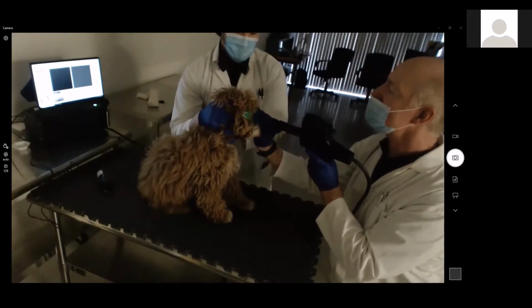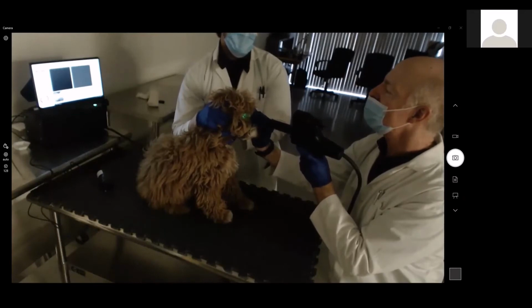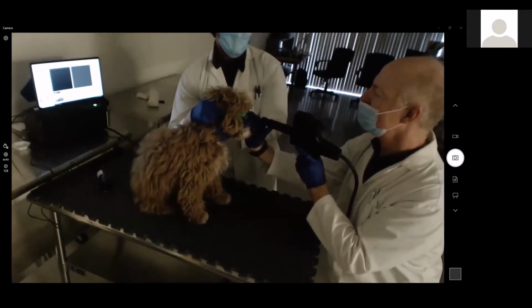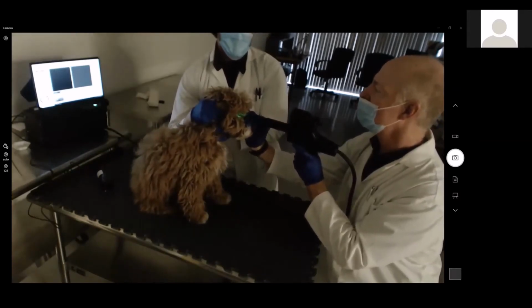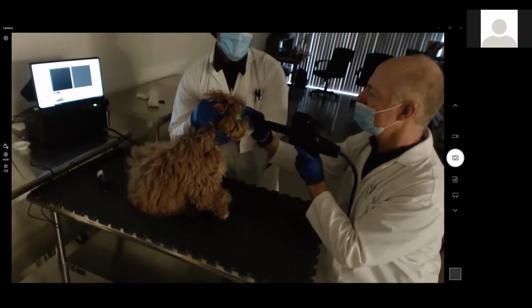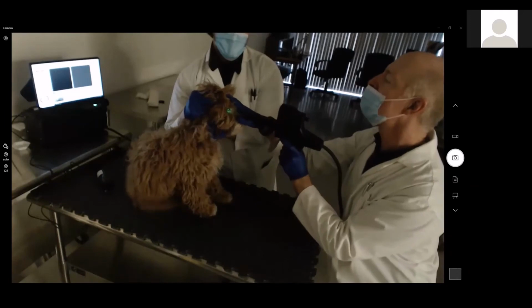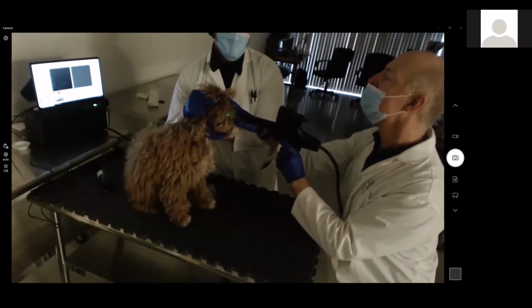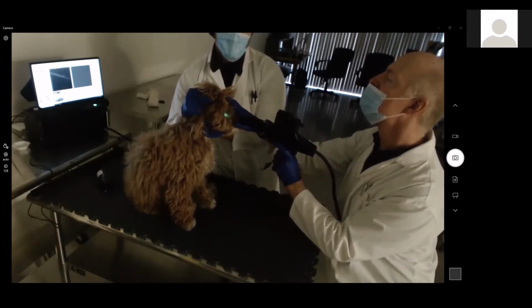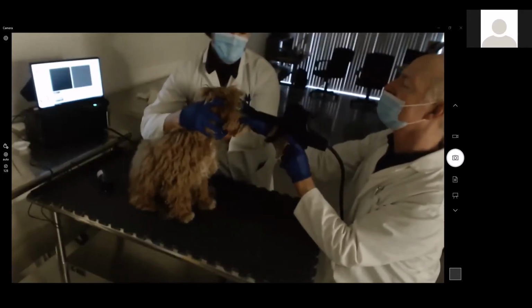Okay, is the system on? Good boy. Yeah, you're doing really well. Can you taste the kibbles on my finger still? Got a little hair on your eye here. Okay, good job. Doing good. Almost there. Keep it steady. Thanks.